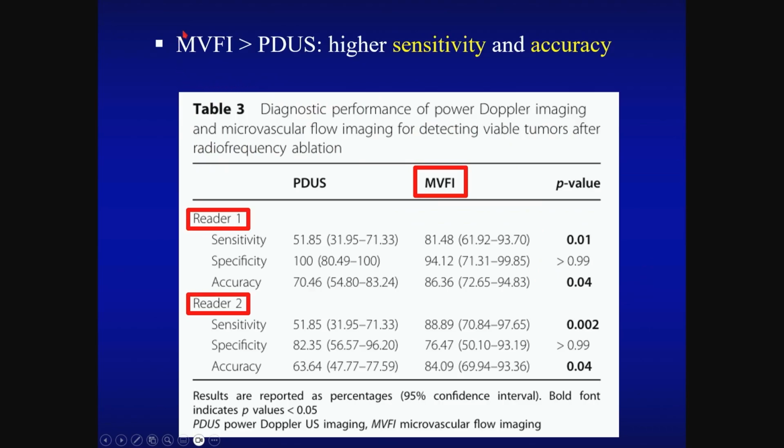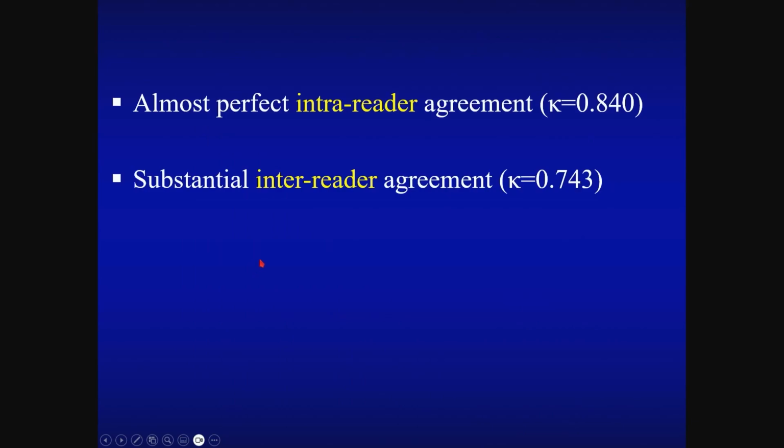Microvascular flow imaging achieved higher sensitivity and accuracy in both reader 1 and 2, and intra-reader and inter-reader agreement was almost perfect and substantial in microvascular flow imaging.